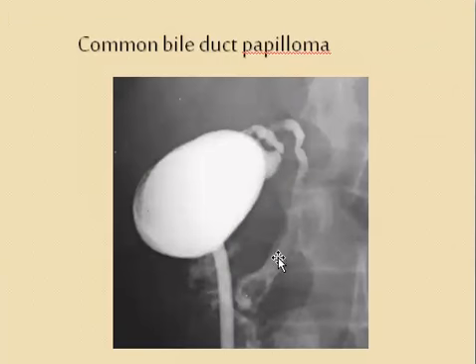Common bile duct papilloma. This is the one. This one is the common bile duct. This one is the cystic duct, and this is the gallbladder.